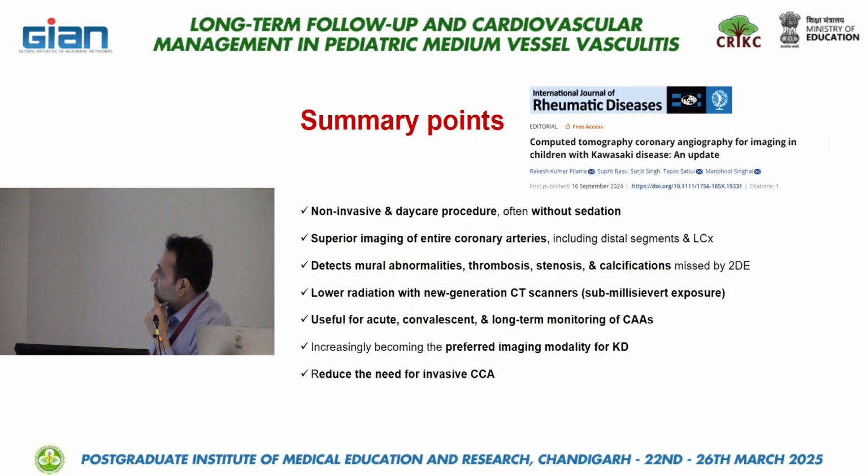So to summarize, it's a non-invasive, daycare procedure. A child comes to the daycare in the morning at 9 a.m., we perform the procedure by 11 a.m., and he will go home with a report at 12 p.m. It's a luxury that we can have, in 4 hours, a procedure with a report in hand.